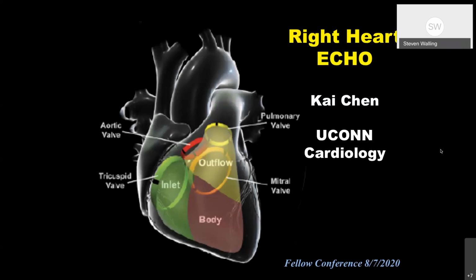Okay, so I'm going to get started. Today's talk is mainly going to focus on the right heart echo. And the right heart is almost always considered to be a forgotten or overlooked half.